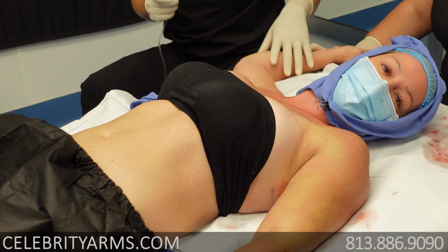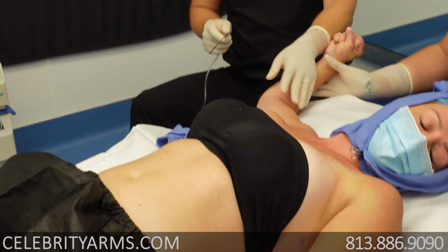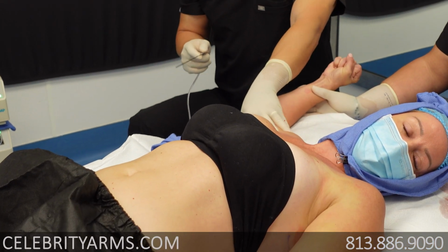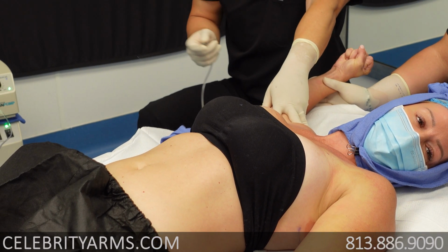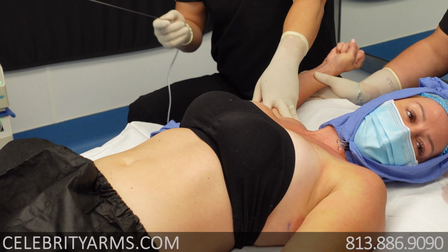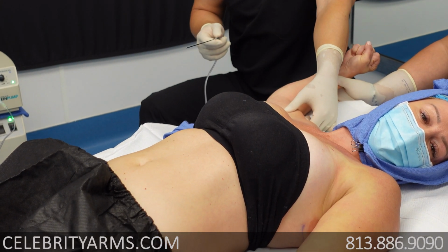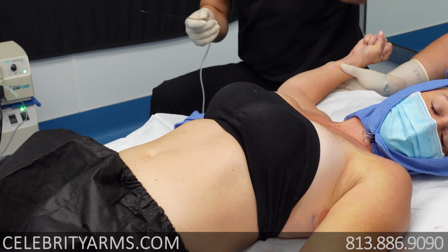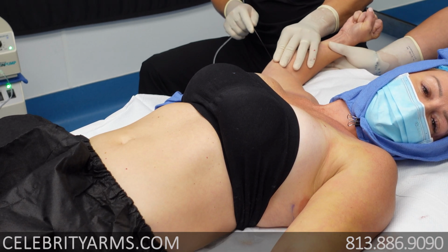Okay, well, I'm gonna go ahead and get started so that everyone can see. Can you just hold this tight? Sure. So we call this our boot camp because when the patients are tightening their arms and other limbs, it gives us a lot better control. And this is a technique that I pioneered over 10 years ago, and it's not the normal thing. I don't know of any other doctor that has their patients tensing and tightening their muscles. So this is our unique technique here, okay? All right.